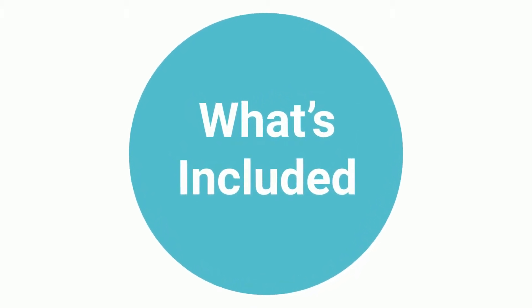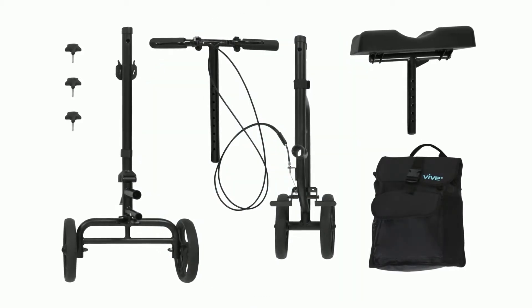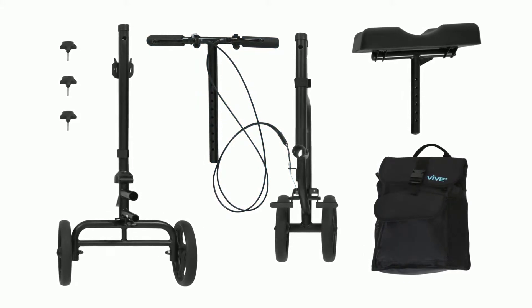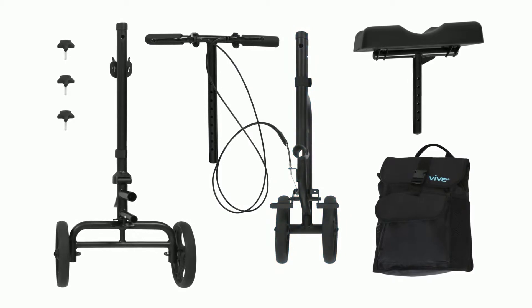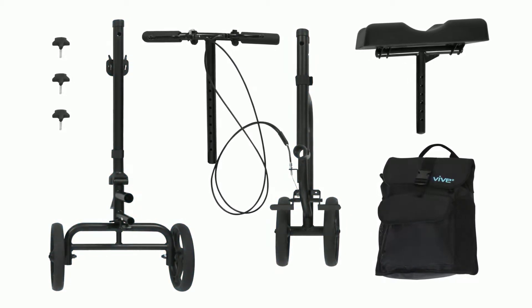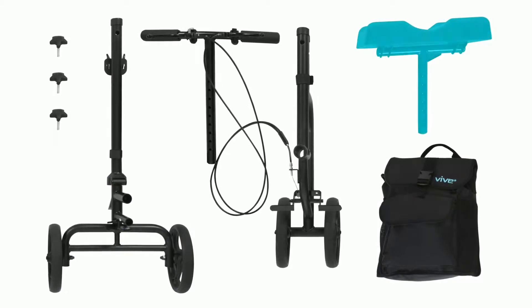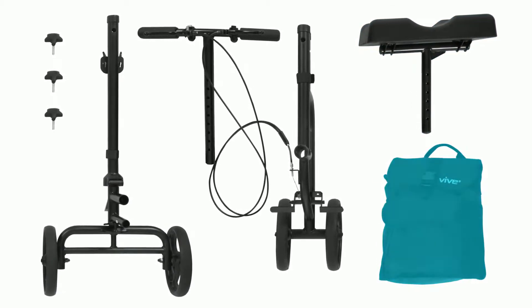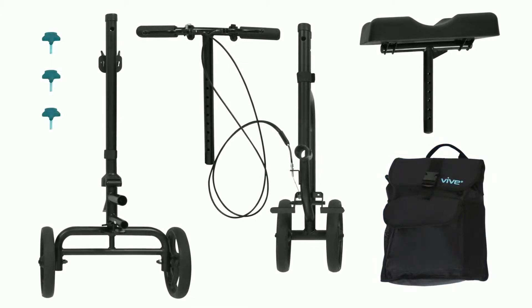Included with your Vive Knee Walker is one pre-installed steering column, one front frame section, one rear frame section, one adjustable knee pad, one carry bag, and three screw knobs.